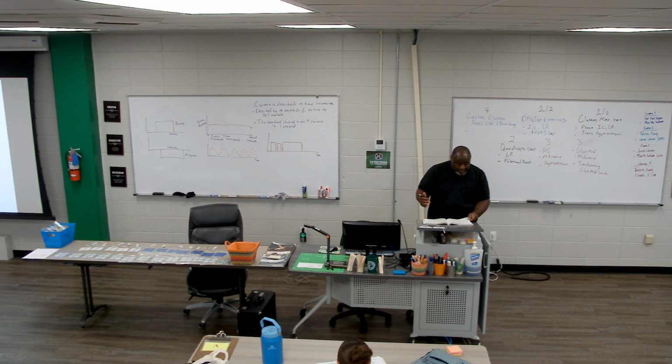Polyphasic means it's comprised of 3 or more phases, and they are felt and released from the device like bursts. So it's going to feel like bursts of electrical energy. But it still will feel the same to the patient as if I was using monophasic or biphasic, but it's released from the machine as bursts.